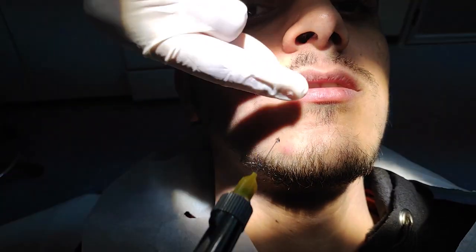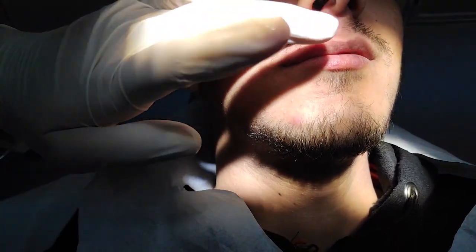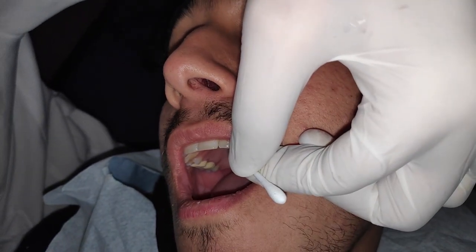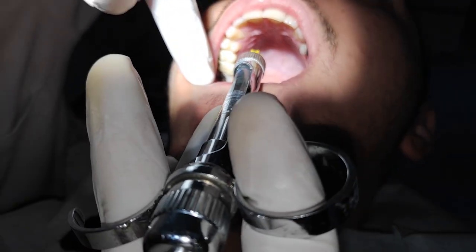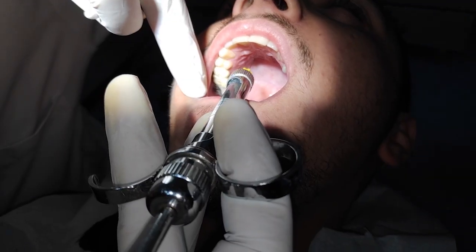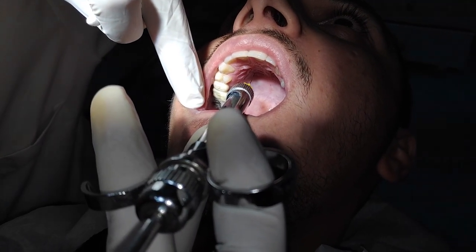When we finish, we give a soft massage to help the anesthesia diffuse. For palatal infiltration, after applying topical anesthesia, we apply pressure because it is one of the most painful places to give anesthesia. We apply pressure along with slow deposition to reduce the pain.